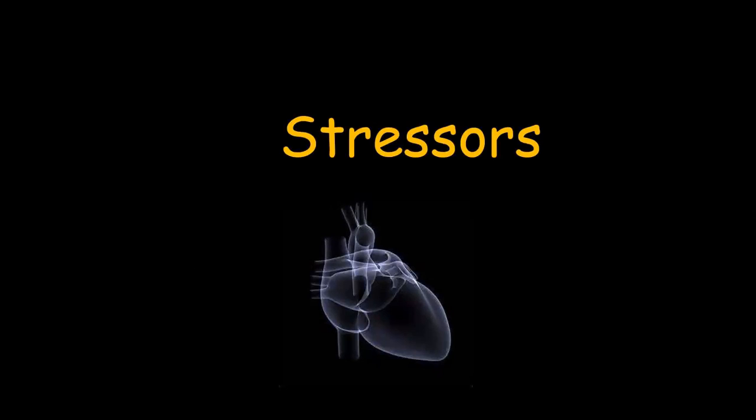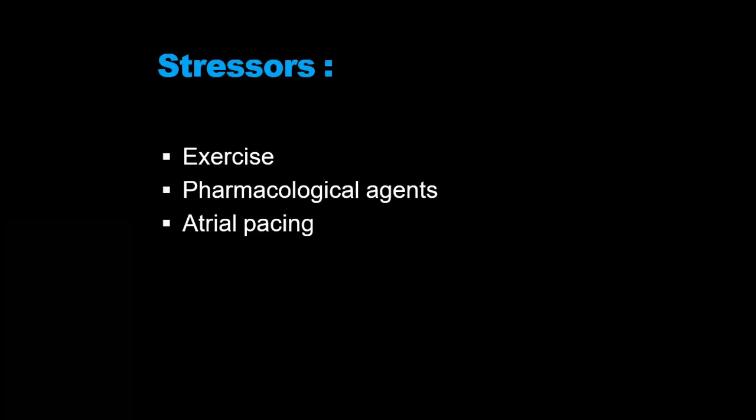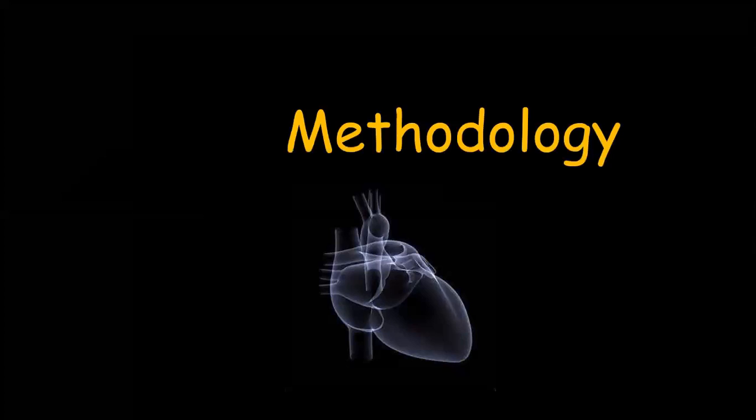So what are the stressors? It is an echocardiography which is normally done after giving a patient some form of stress. So what are the stress? These are exercise, pharmacological stress agents, and atrial pacing. These are the current 3 stressors we apply during stress echocardiography.